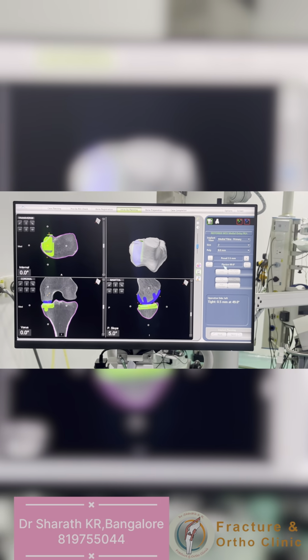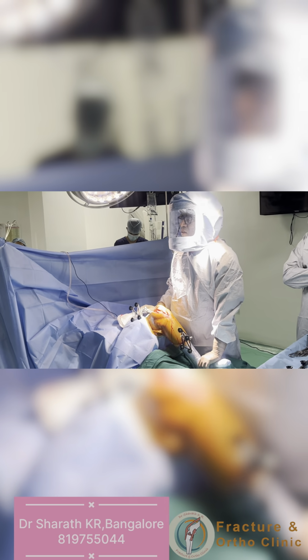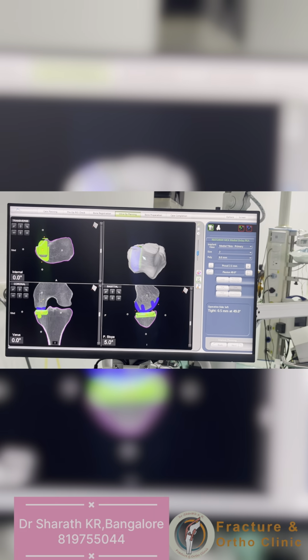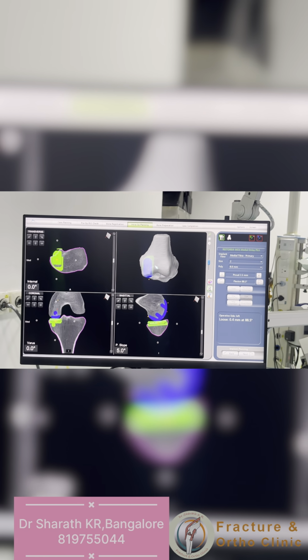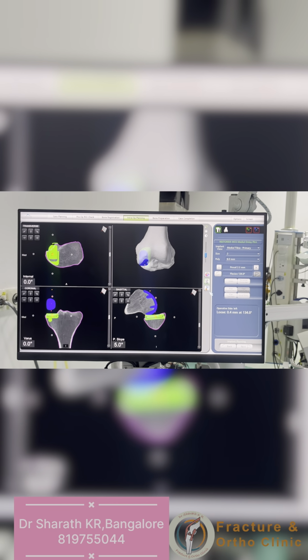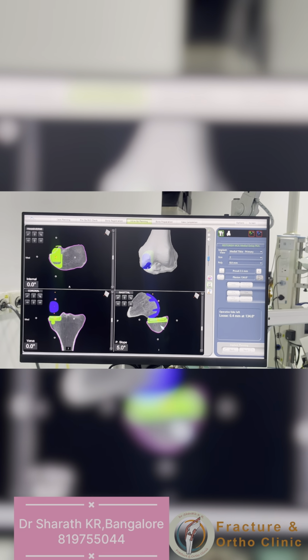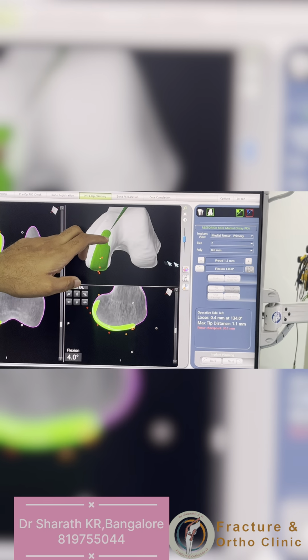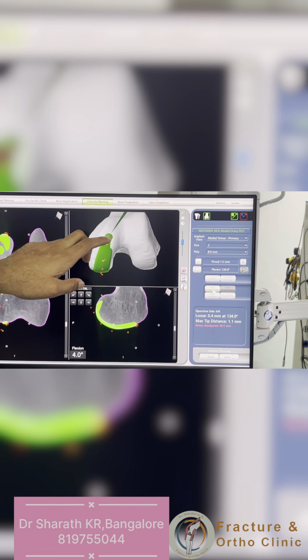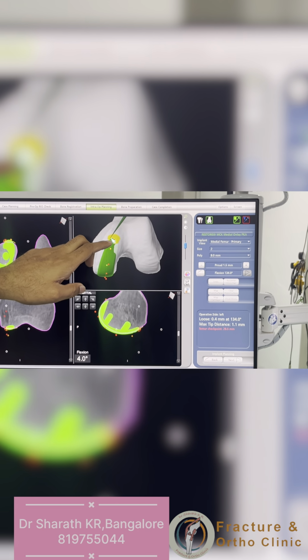And the slope of the tibia, femoral component flexion, femoral component orientation, and inflection of the knee, the femoral component should be in the middle of the tibial component. You can see here green, blue, and green. That means that at the flexion, at the extension, all throughout the range of movements, this femoral component, when the knee is loaded, is in the middle of the tibial.